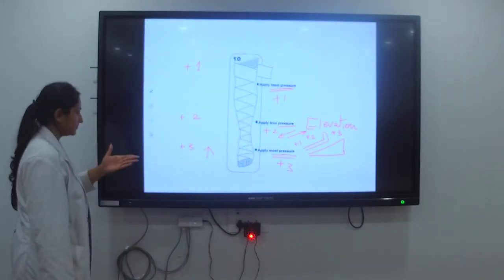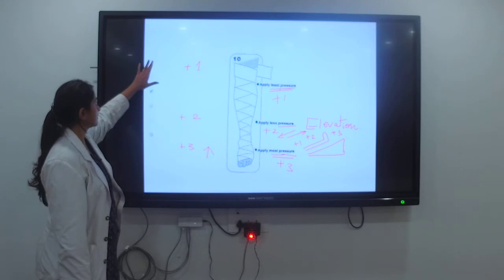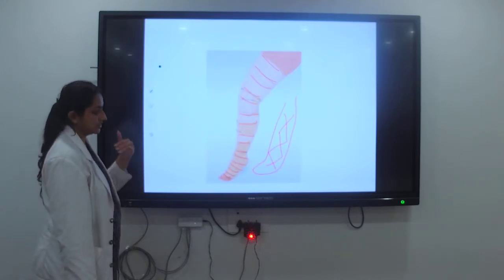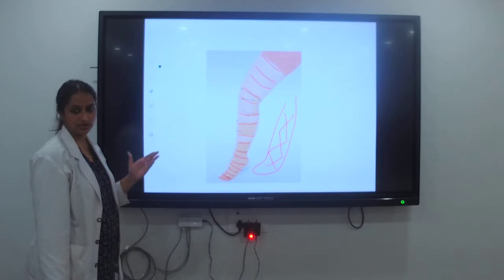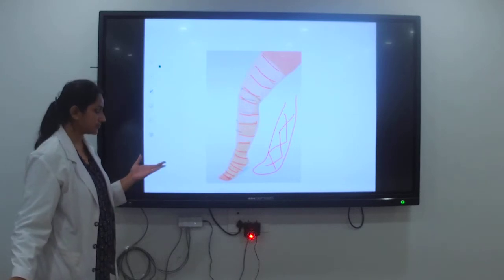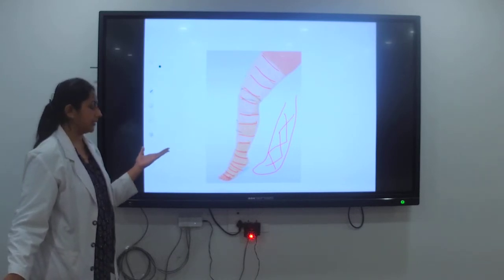Now you have understood where the pressure needs to be maintained. This is the method we have gone through for the lymphatic drainage crepe bandage technique, which you need to apply during application.